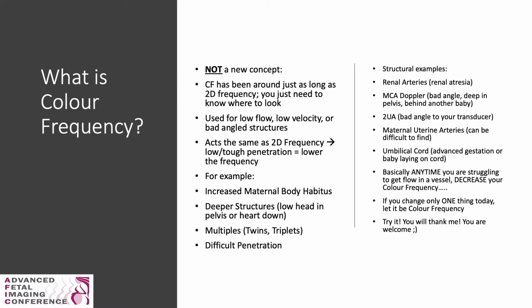So what is color frequency? I just want to make it abundantly clear to everyone here that this is not the same as color gains. Again, color gains and color frequency are two separate functions. To start off with, color frequency is not a new concept. It has been around just as long as 2D frequency. We just need to know where to look.